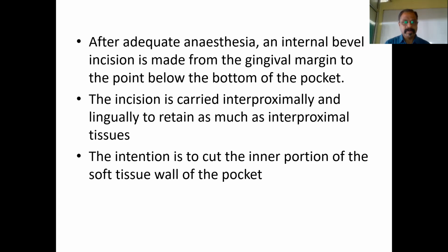a little bit more. This internal bevel incision is carried interproximally and lingually to retain as much interproximal tissue as possible. The idea is that we want complete closure of your interproximal area. Otherwise, there will be a dead space there, and your healing will be hampered. So the intention is basically to cut the inner portion of the soft tissue wall of the pocket.